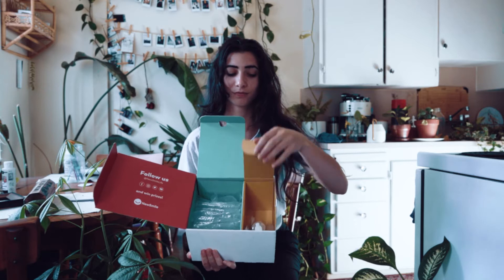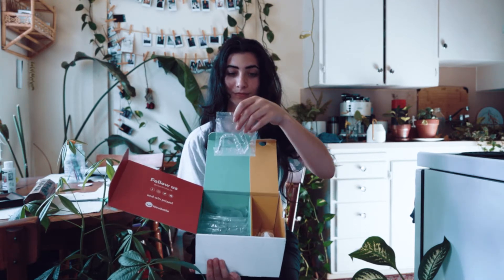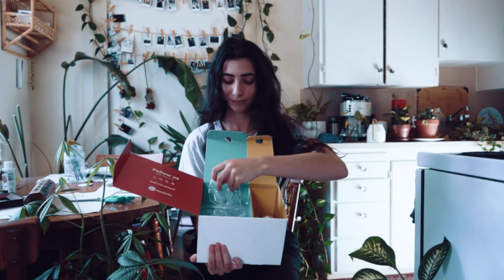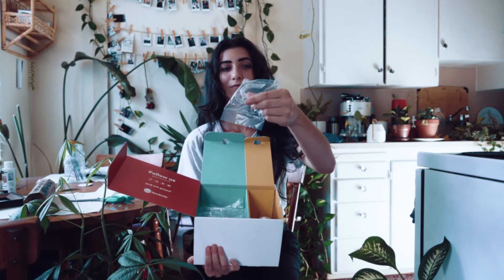Inside the aligners you have week 1 all the way to week 20. You also receive a retainer at the very end, and this is what it looks like.